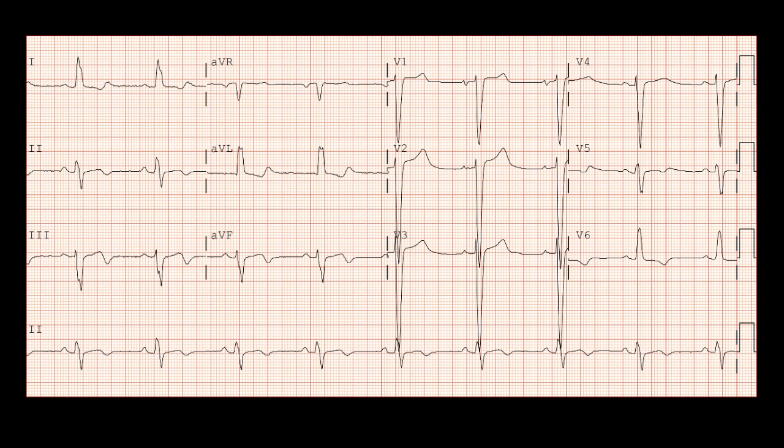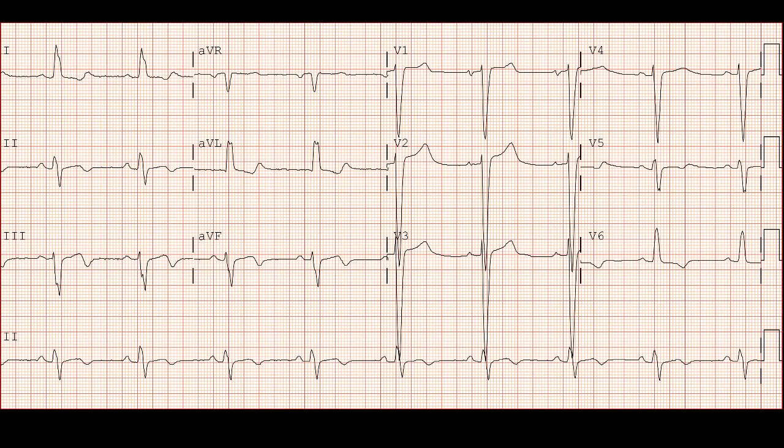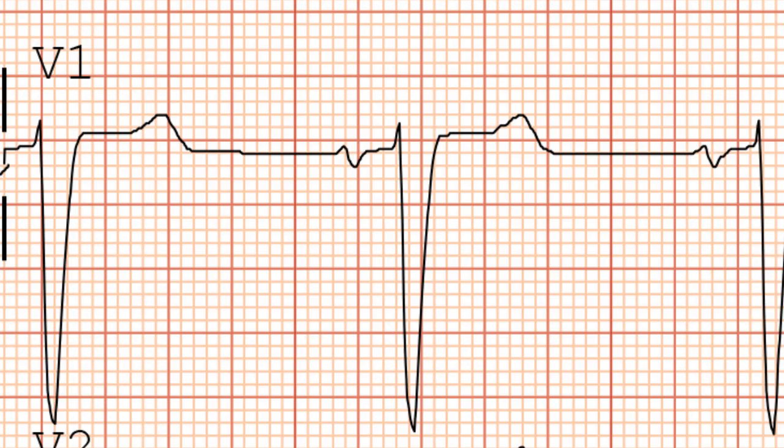Let's go ahead and look at another one. On this EKG, we can see the waveforms pretty well in a number of leads. So, let's just take a closer look at lead V1. The PR interval we measured from the beginning of the P wave to the beginning of the QRS complex. You can see here it's less than five small boxes, so it's normal.